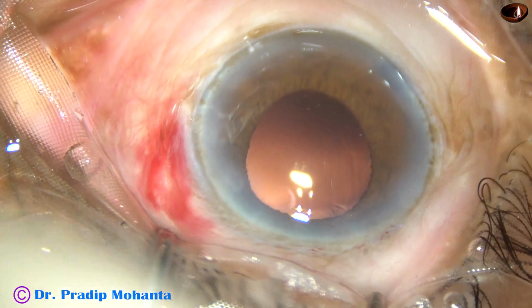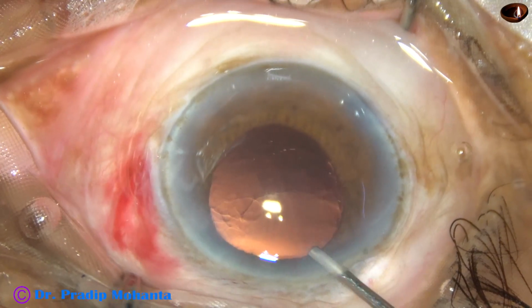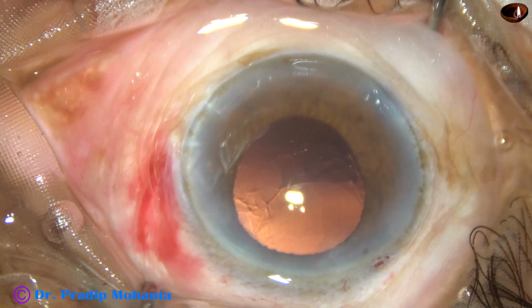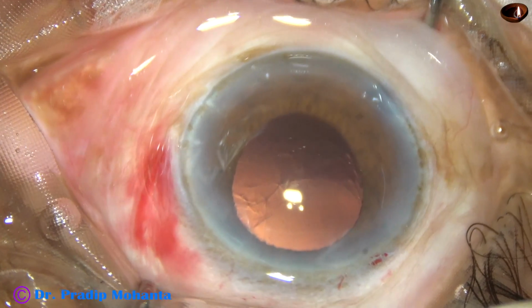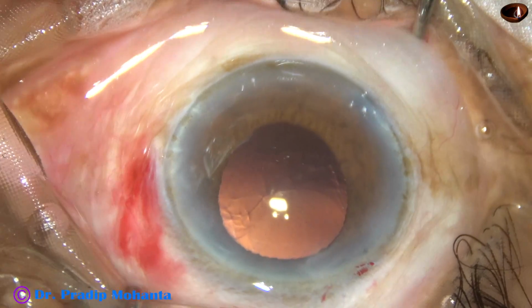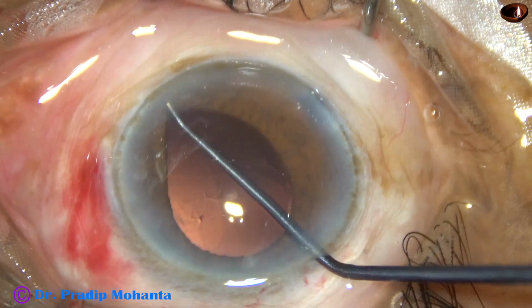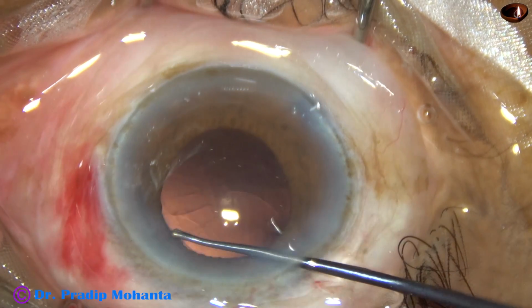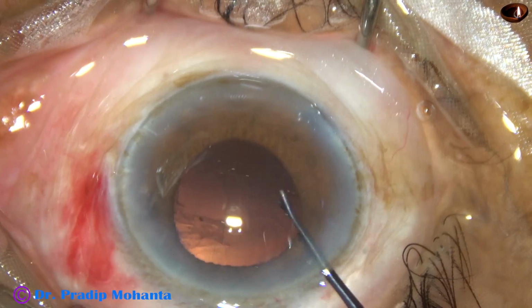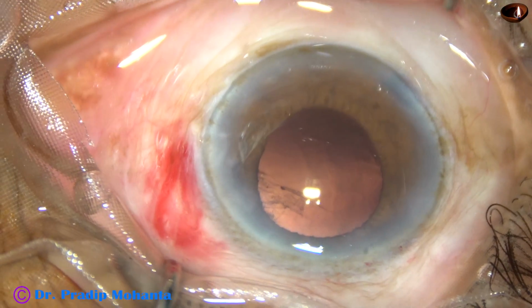And now I'm going to inject visco to check with a Y retractor. It is an instrument which is shaped like the letter Y, which can retract the iris and you can see whether there is any cortex remaining anywhere. When the pupil is not fully dilated, when you think that there may be some cortex hidden by the iris, you can use this instrument.